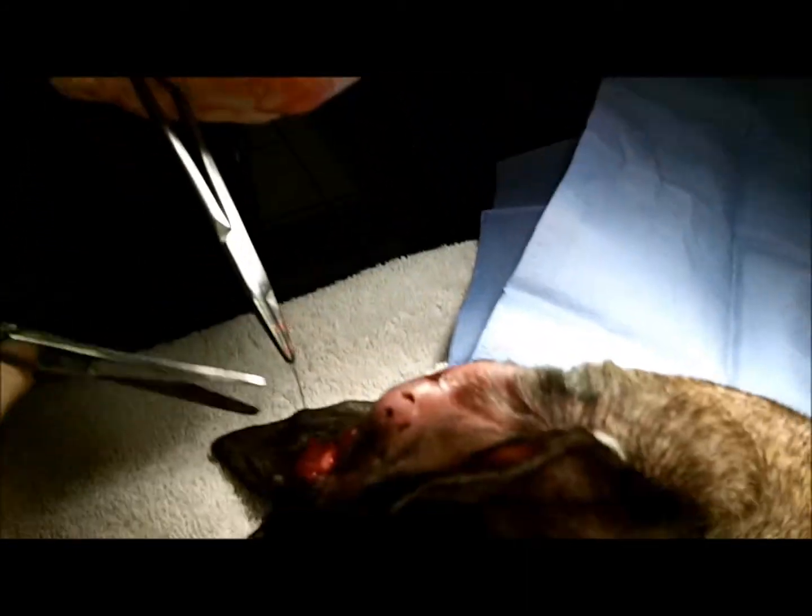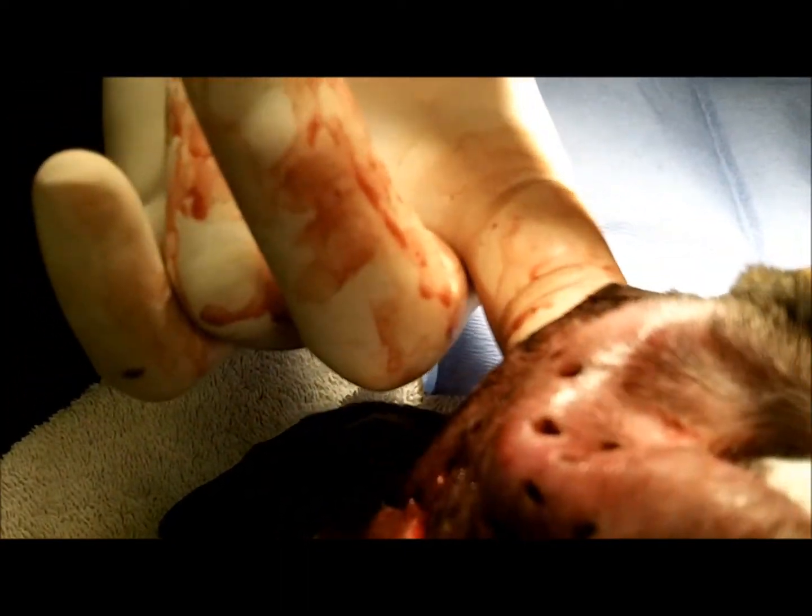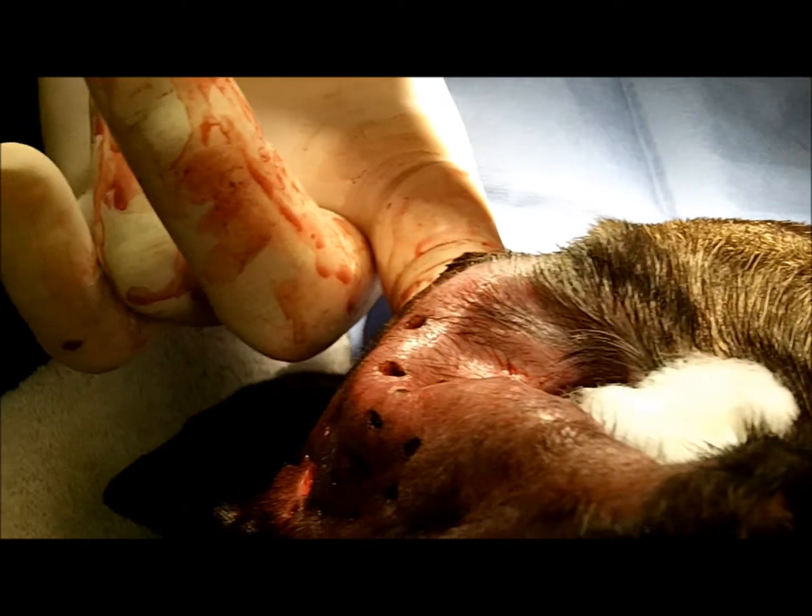Here I sutured the ear to the top of the head so you don't have to put the heavy bandages on. Those heavy bandages can be a little bit dangerous, so this is actually a much better way to go. There you can see it.